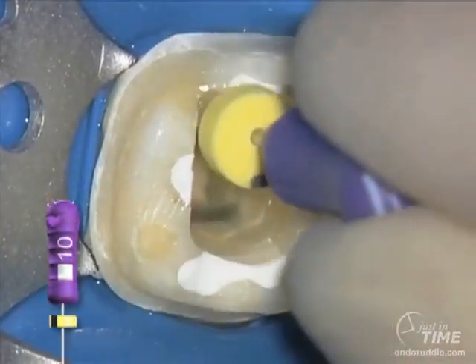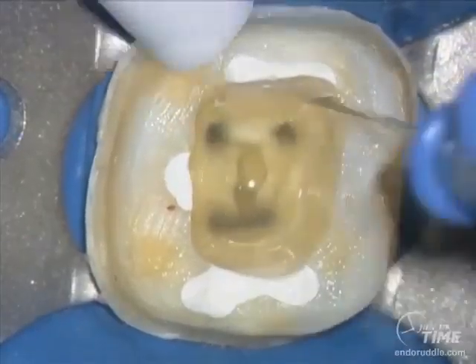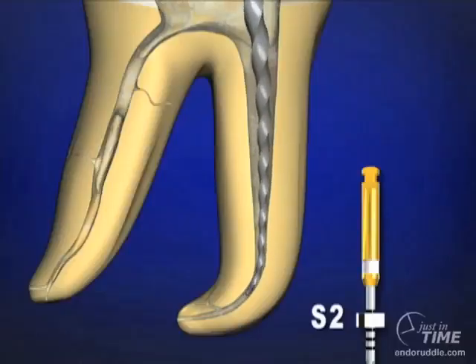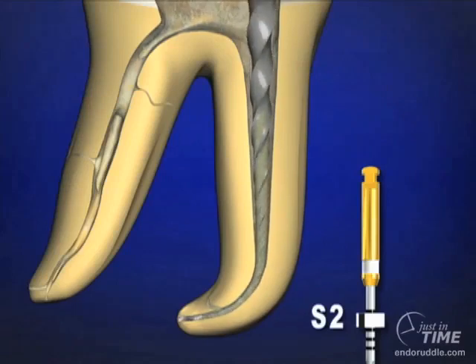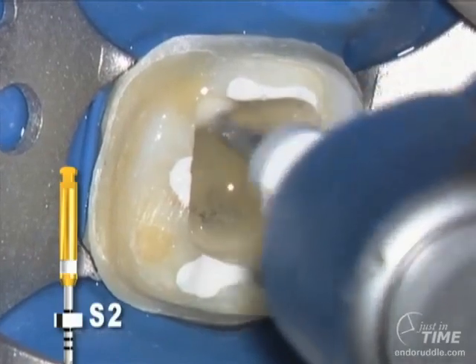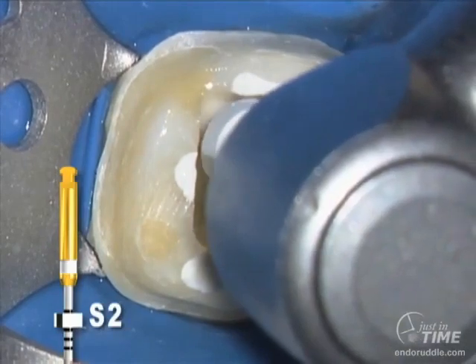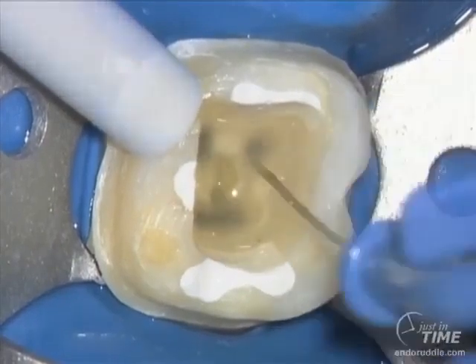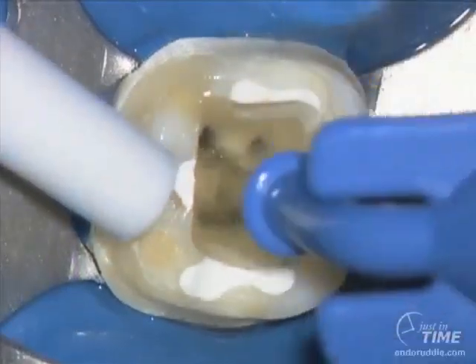We can now go to the S2. The S2 floats into the canal, it follows the expanding shape, and again you begin to brush. And again you're carrying another shaping wave progressively deeper towards the apical 1/3 and into the apical 1/3 of the canal. Again, brush away from furcal danger. Maximize remaining dentin. Relocate the preparation coronally away from any external root concavities. Irrigate, recapitulate, and re-irrigate. These are little redundancy steps, but redundancy is the mother of excellence. You always are one file away from victory and one file away from defeat.